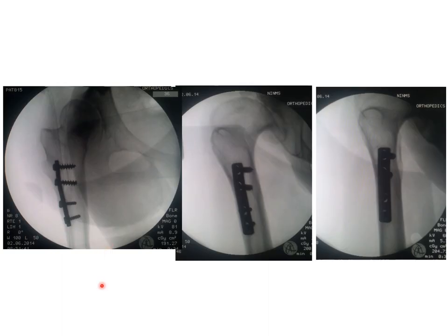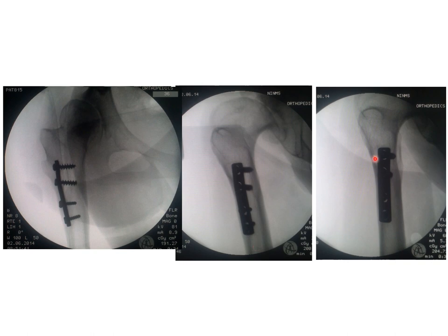These are three views obtained under anesthesia with the image intensifier. As you can see, the plate is totally buried under the bone, making its removal difficult. On the lateral view, you can see the obvious angulation of the femur. You take these views, put them on the computer, and try to do some planning drawings.